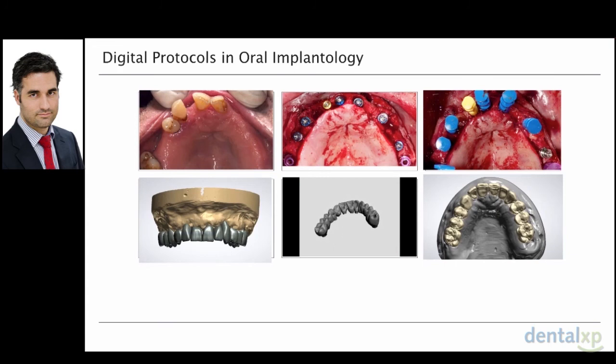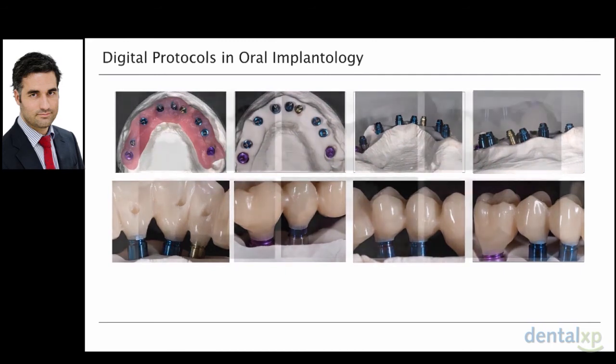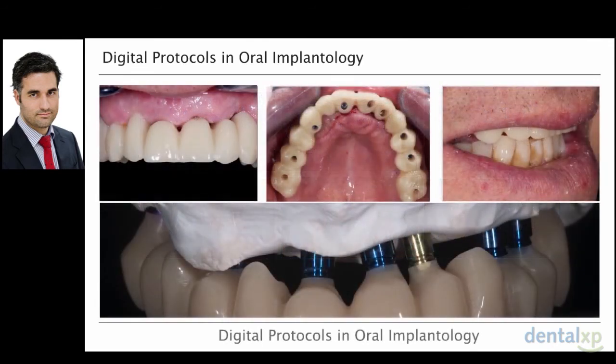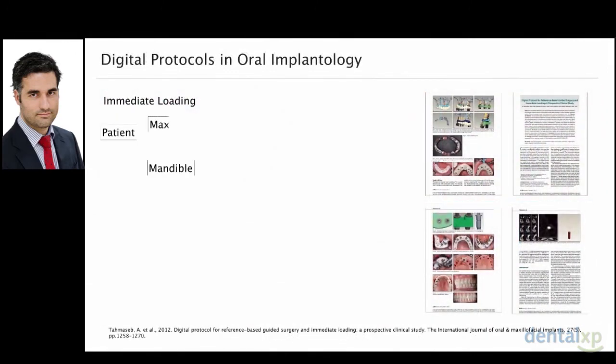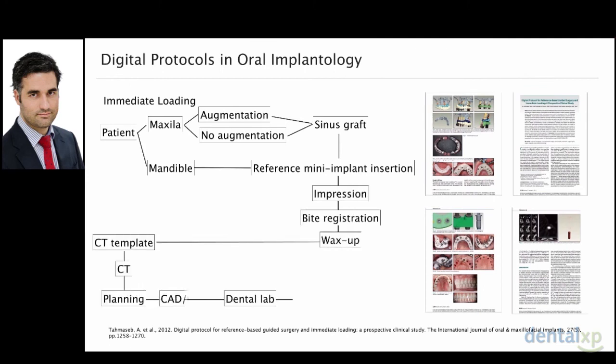So after that, Daniel designs me the provisional, a PMMA provisional. As you can see, all the screw holes are in palatal, so the aesthetics should be okay. And this is the PMMA prosthesis that arrives to Daniel. Then he checks it in the lab, and he sends it back to me, where I deliver this prosthesis. It fits okay, and as you could see, I do an impression, I send it to the lab, but I have to wait 72 hours for my prosthesis.